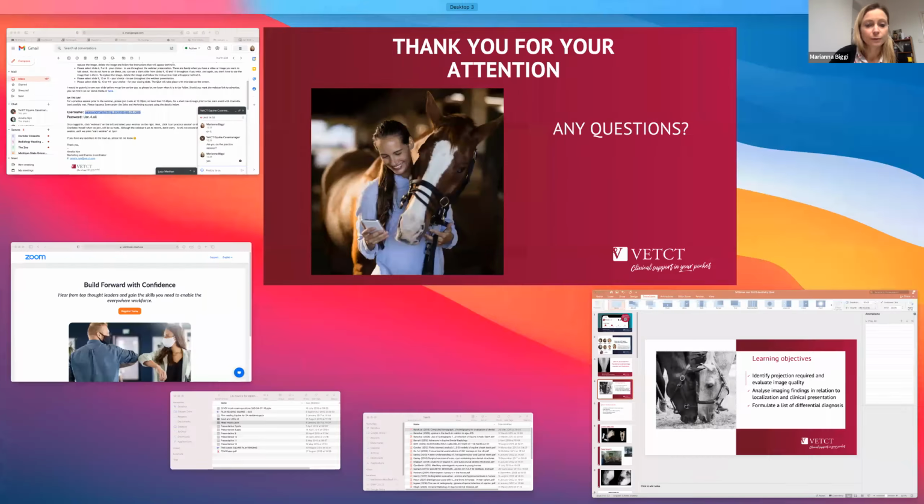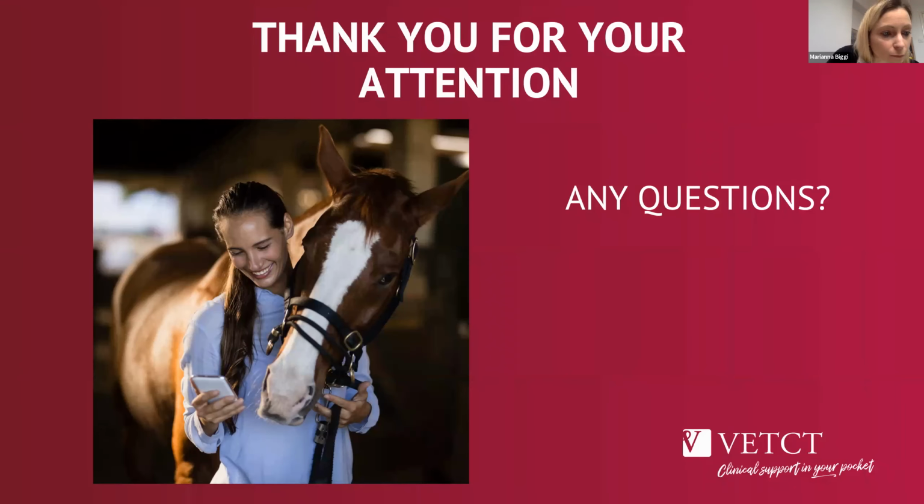Hi, Marianna. We've got a question from Camilla Lumsden that's come through on the chat. How often do you think the radiographic periapical changes actually equate to periapical infection in buccal fractures?